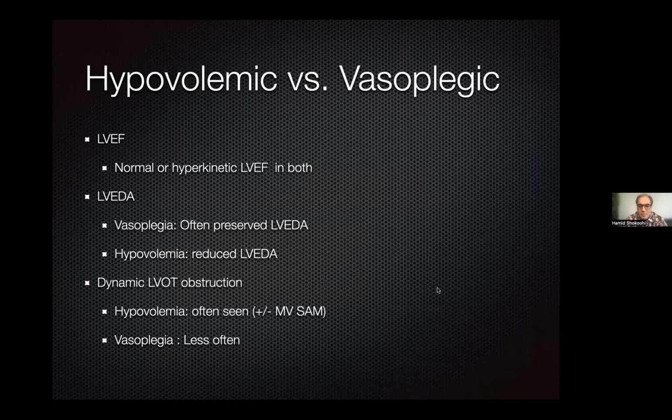But for vasoplegic cases, as we discussed, because they have that area preserved, it is less likely to happen. Can we measure this one? Probably not.